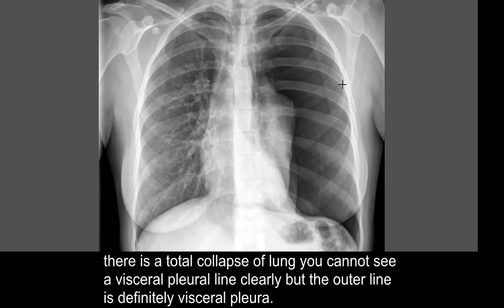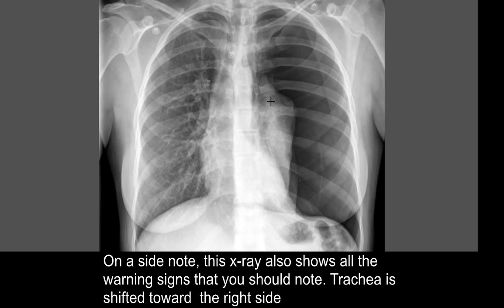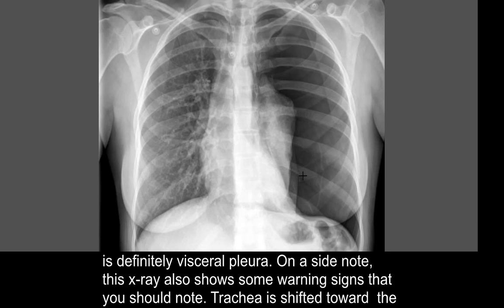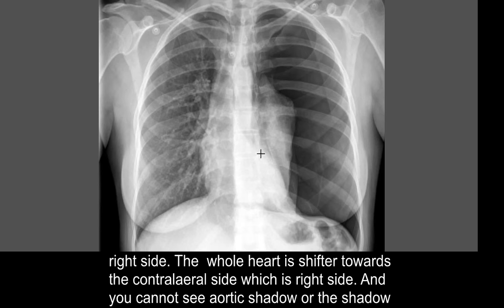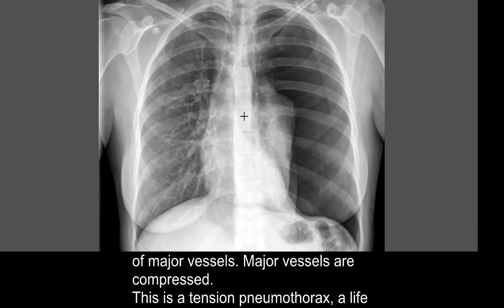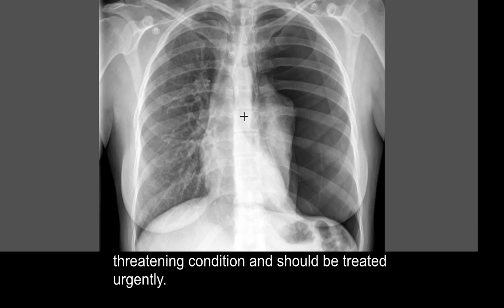Note that because there is total collapse of the lung, you cannot see the visceral pleural line clearly, but the outer line is definitely visceral pleura. This X-ray also shows some warning signs: the trachea is shifted towards the right side, the whole heart is shifted towards the contralateral right side, and we cannot see the aortic shadow or the shadows of the major vessels — they are compressed. This is a tension pneumothorax. It is a life-threatening condition and should be treated urgently.